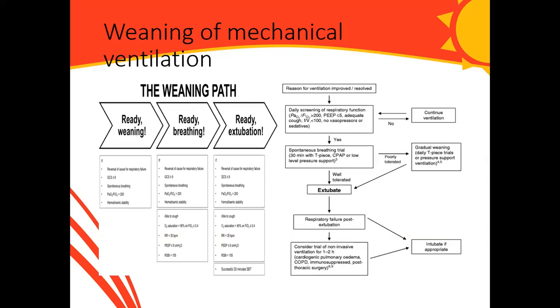Proceed to extubation if the spontaneous breathing trial is well tolerated. If there is respiratory failure post-extubation, you want to reintubate if appropriate, or you want to consider a trial of non-invasive ventilation. So this is a very useful flow chart for weaning of mechanical ventilation.